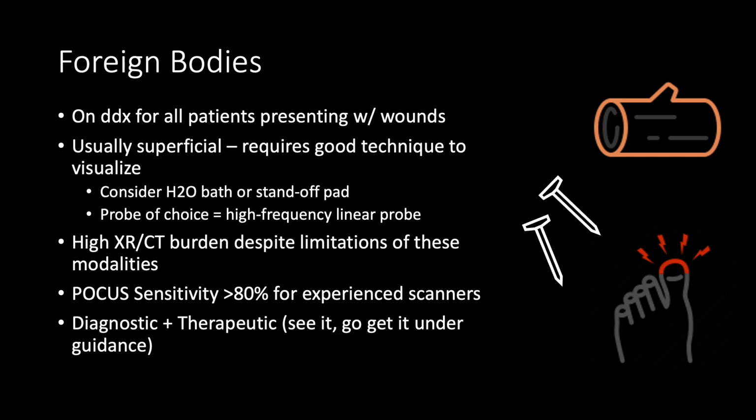For this reason, ultrasound has emerged as a better modality for both visualizing structures and guiding their removal with dynamic imaging. One study that I read said that there's a sensitivity of greater than 80% for experienced scanners to identify and remove the foreign body, which is pretty good for a point-of-care application.